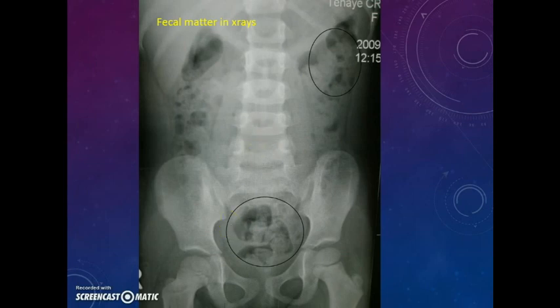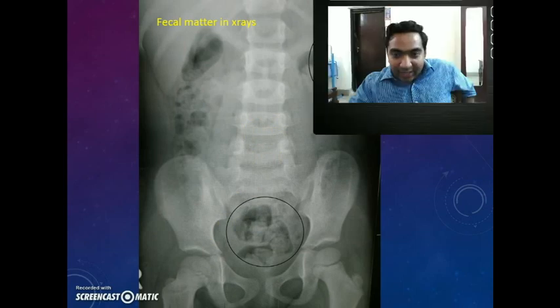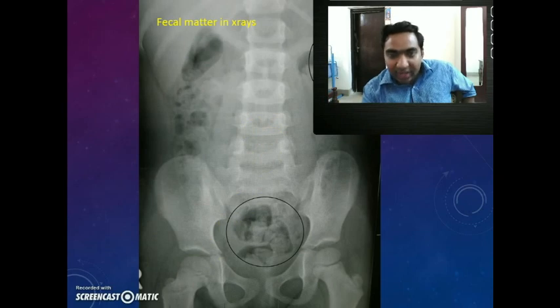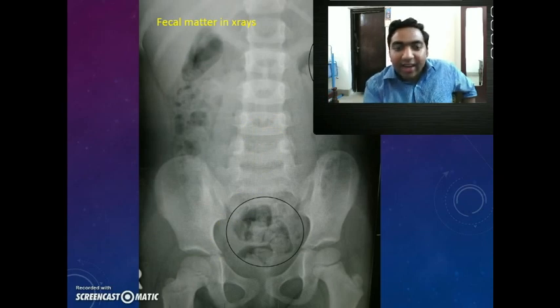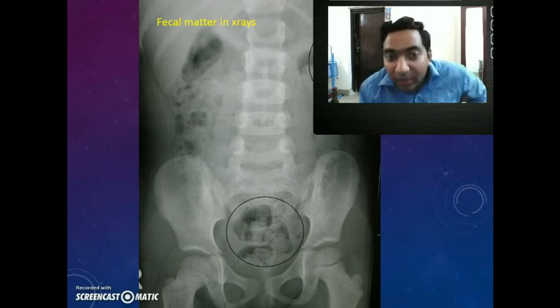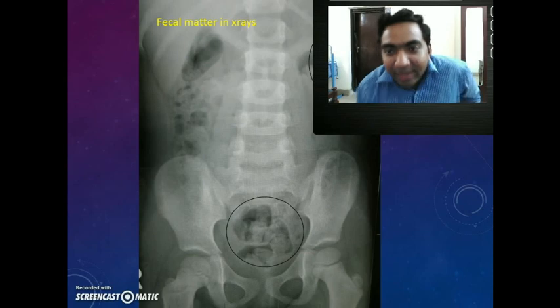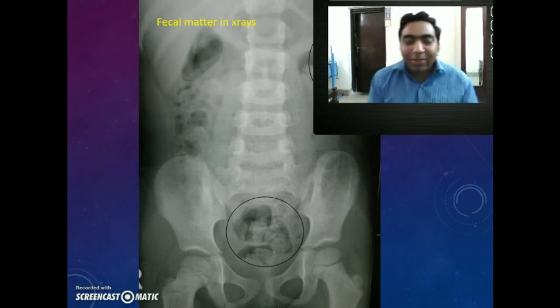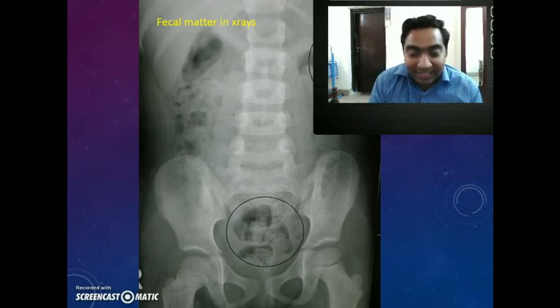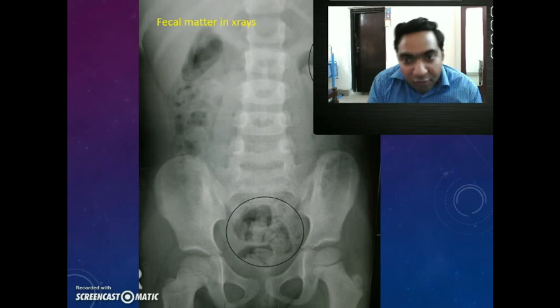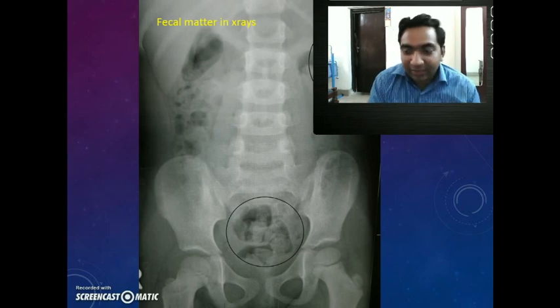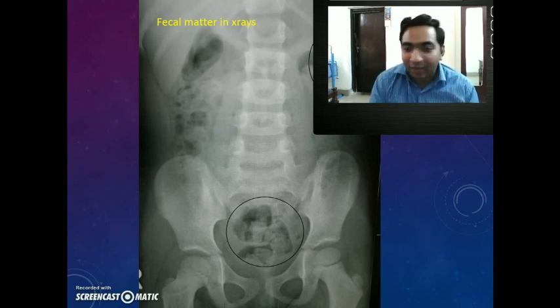One of the most common X-ray findings we see is this dark granular circle. This may be the most common finding we see in an X-ray, but they are fecal matter. Don't think it is a pathology — it is just fecal matter we are seeing in the X-ray.